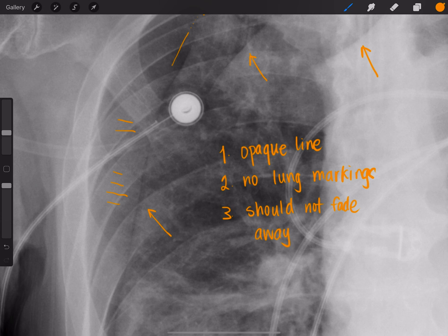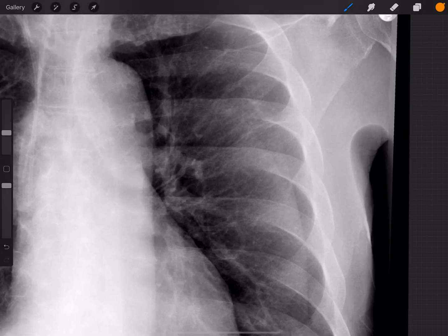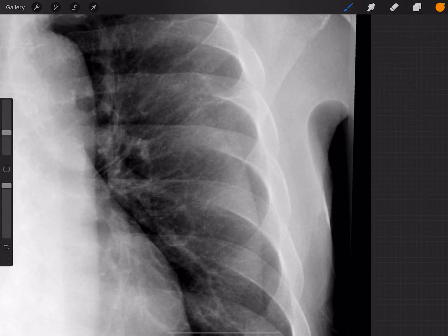Let's take a look at another example — this is the second case. What would you say about this one? Is this a skin fold or is this a pneumothorax? This is a skin fold again, and not a pneumothorax.